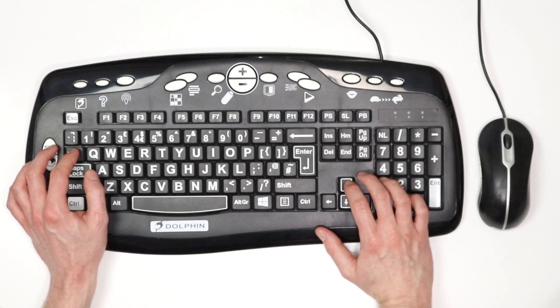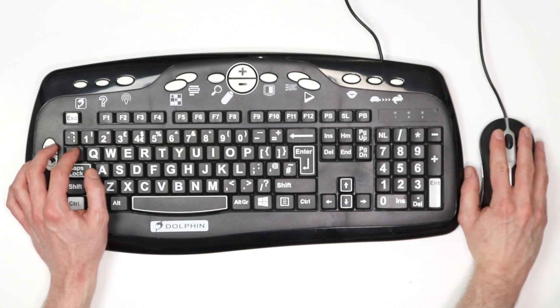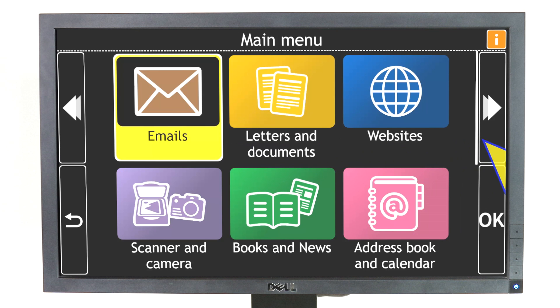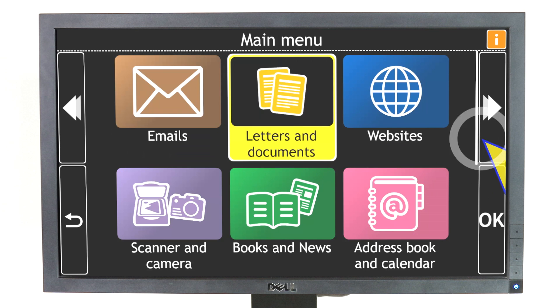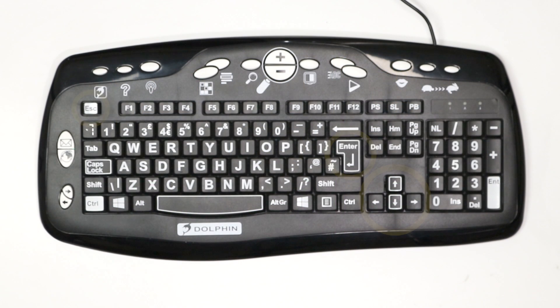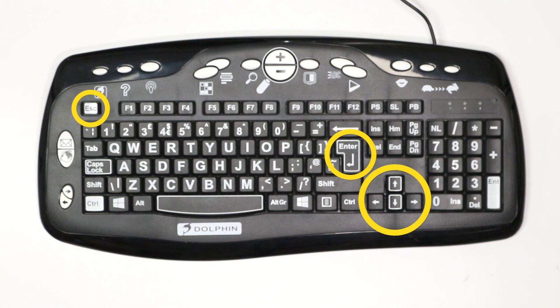In this video, you'll learn how to control GuideConnect using your keyboard and mouse. Using a keyboard, you only need to remember four keys to move around the screen.